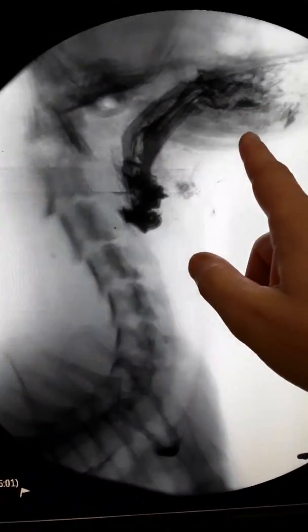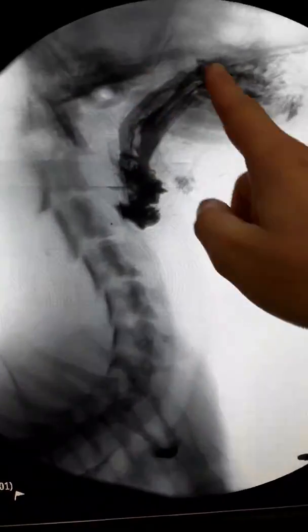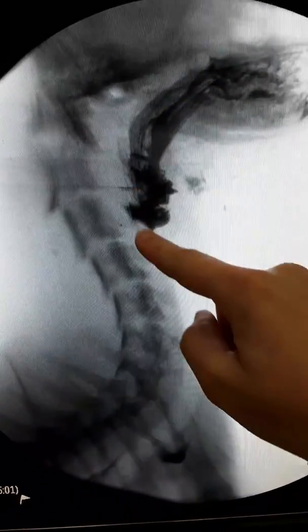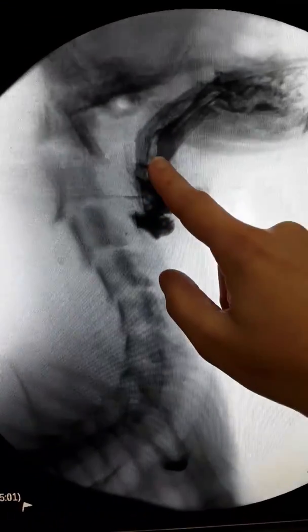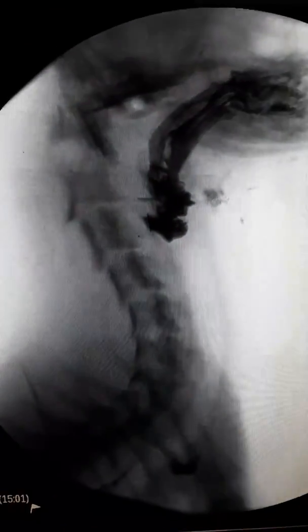She's in mid-swallow on this particular frame, so we can see that she has material in the back of her mouth that has started to move into the top part of her esophagus. Material generally should not be hung up in this spot. We'll watch what the swallow looks like — she swallows, it goes down, but you can see her mouth moving as she repeatedly tries to get that material to the back of her mouth and swallowed. There she gets it down, and then we follow that material through her esophagus.